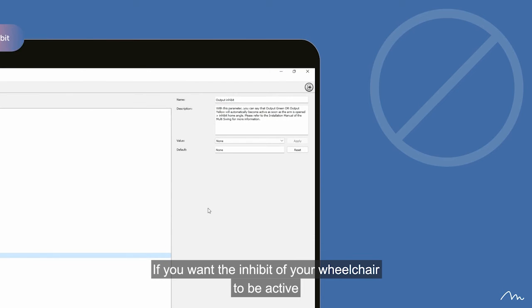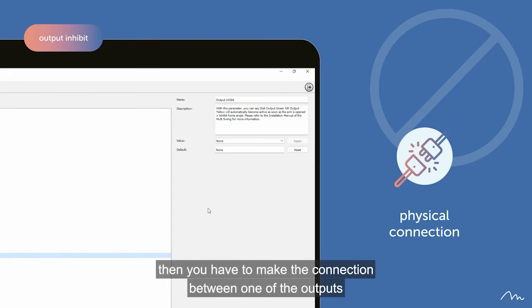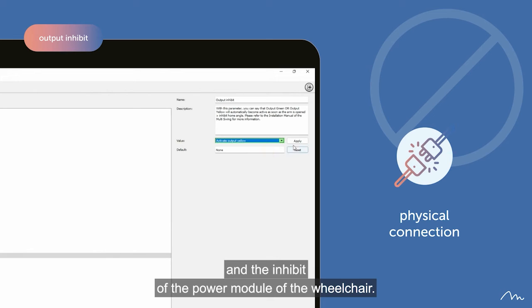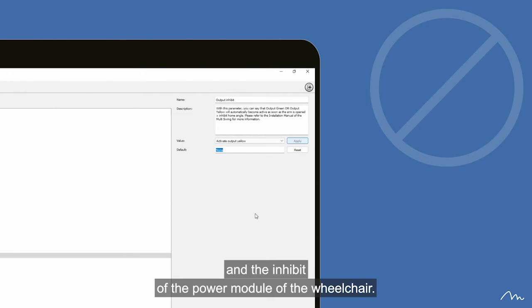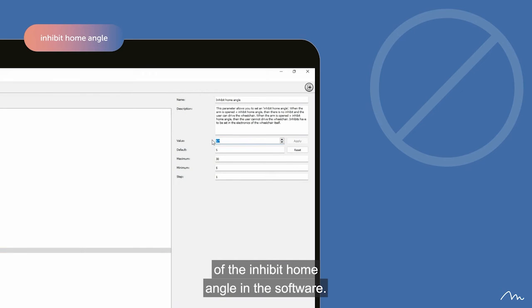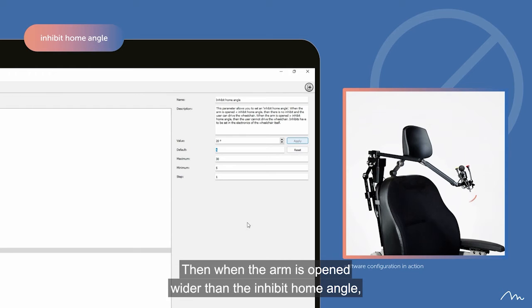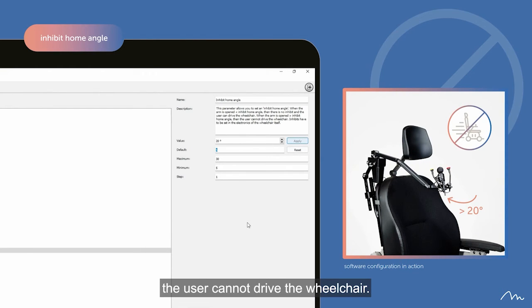If you want the Inhibit of your wheelchair to be active as soon as the arm is opened wider than the Inhibit home angle, then you have to make the connection between one of the outputs and the Inhibit of the power module of the wheelchair. You can adjust the value of the Inhibit home angle in the software. Then, when the arm is opened wider than the Inhibit home angle, the user cannot drive the wheelchair.